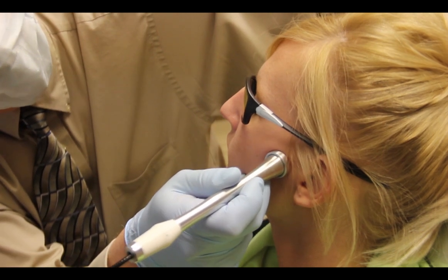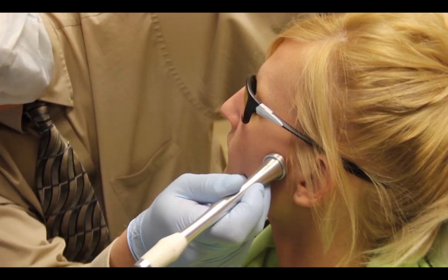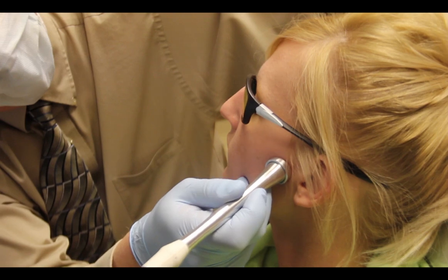Like anything else, this is a little variable, and sometimes you can go a little longer or increase the power slightly.